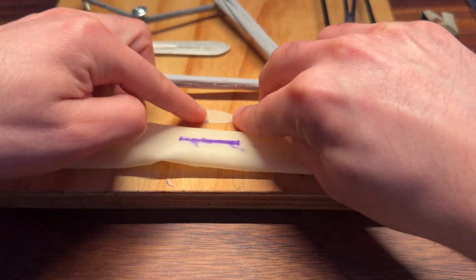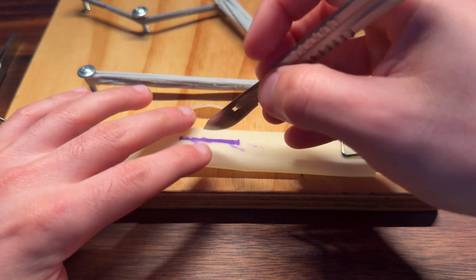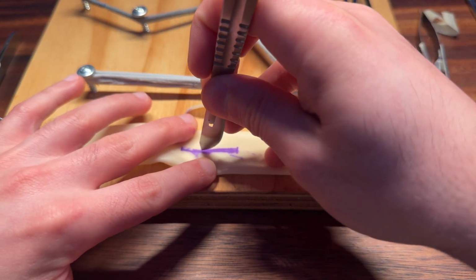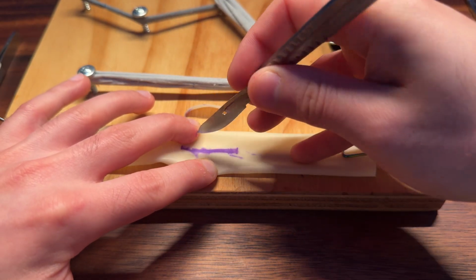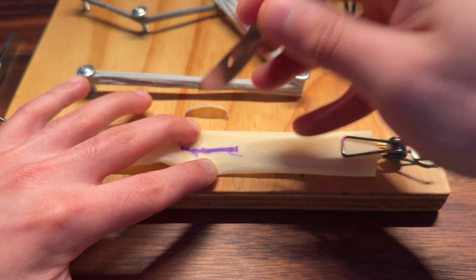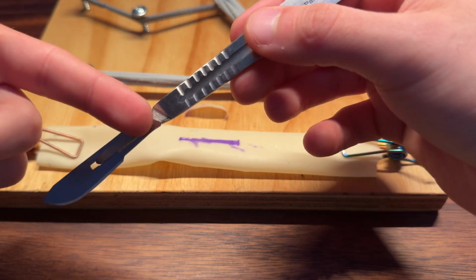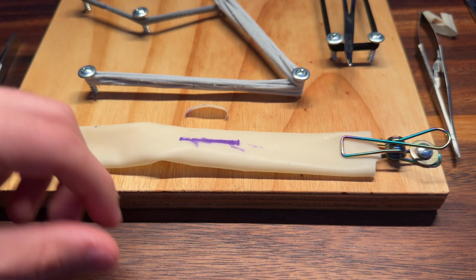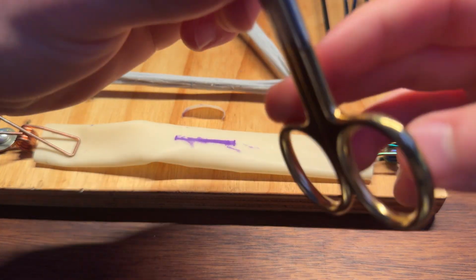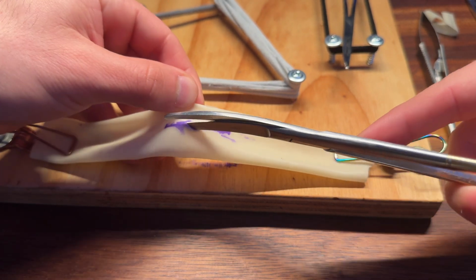So now that we have that prepared, I'm going to put it outside, and I'm going to make my first incision here in the center, and then I'm going to use scissors to open it. I don't really have a good blade. It's not even attached correctly, but it's a 22 blade, used for big skin. After you make your puncture incision, you can go ahead and open it up like so.